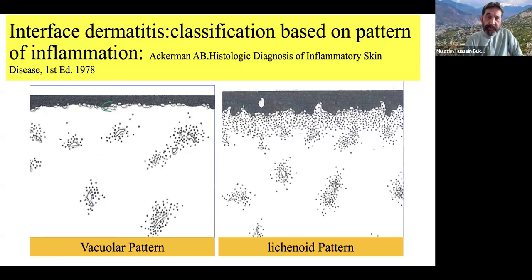And one other important thing, right? All histopathologists can see some mitosis in the dermoepidermal junction. What is the difference between malignant and benign? Now, when there is a benign one in interface dermatitis, you will always see a vacuole. This is called vacuolar mitosis, or in other words, round body mitosis. While in malignant mitosis, there is a hyperchromatic and variable picture and pattern.